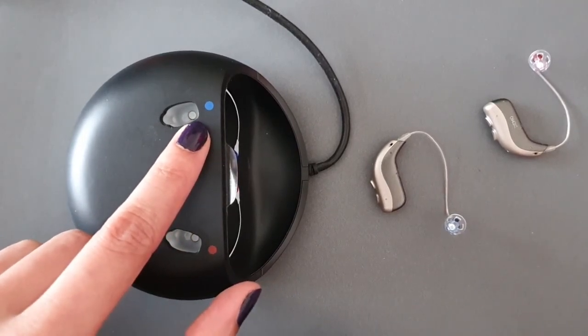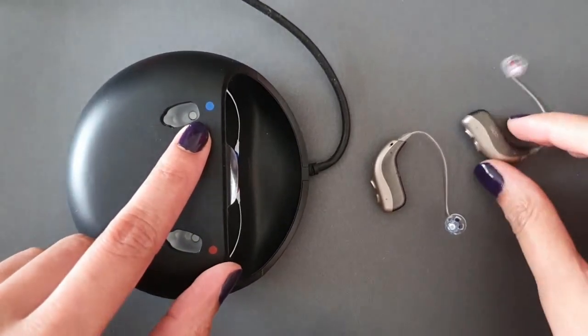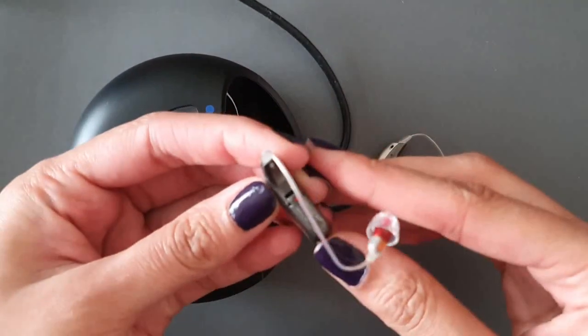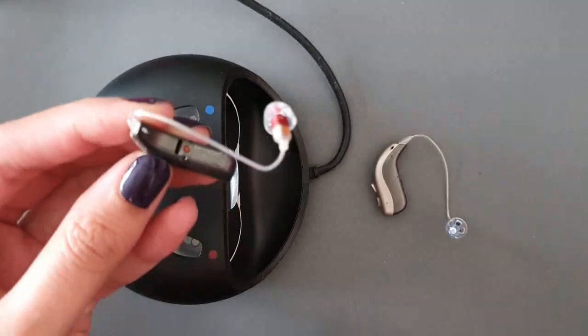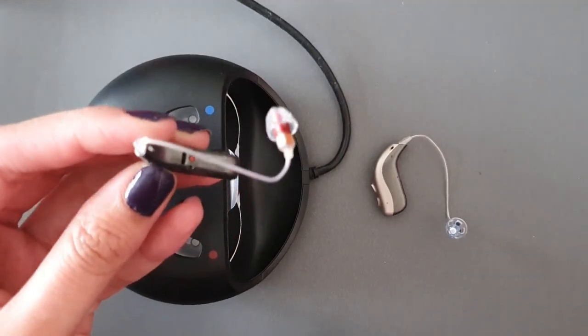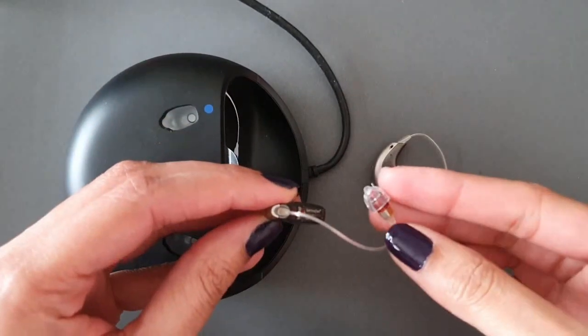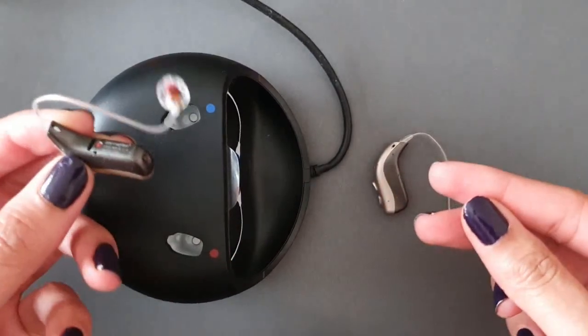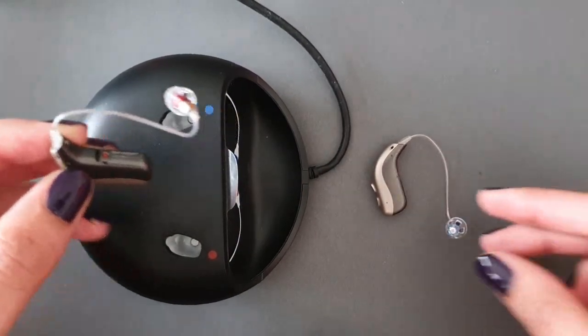One hole is for your right ear, indicated by a red marker, and one for your left ear, indicated by a blue marker. The right side hearing aid has a red dot on the back of the machine, and your speaker wire is also indicated by a red color.